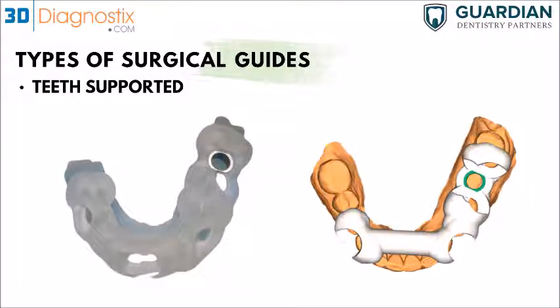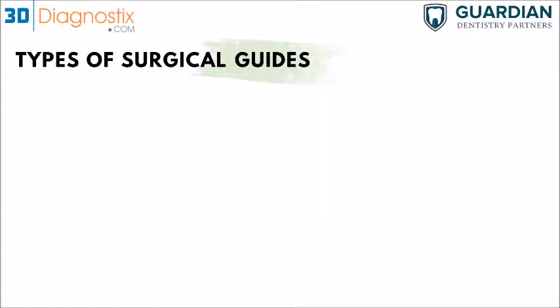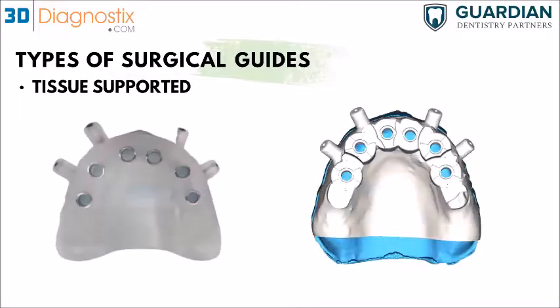So this is, I would say, the most accurate guide of them all, because you have a lot of undercuts and it's basically just resting on the occlusal anatomy of the teeth, and part of it is on the buccal and the lingual as well. So with engaging those undercuts, that would be considered the best kind of support for a surgical guide. The next guide is a tissue supported, and this is on the right side.